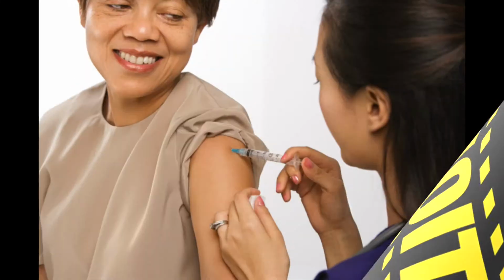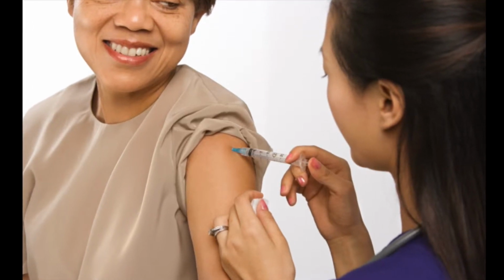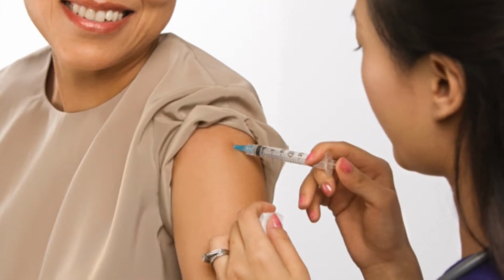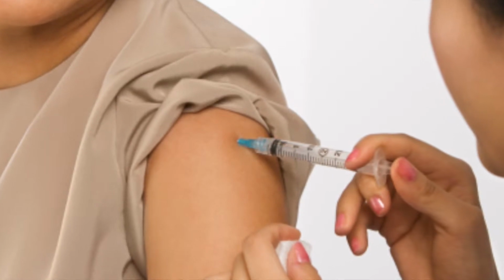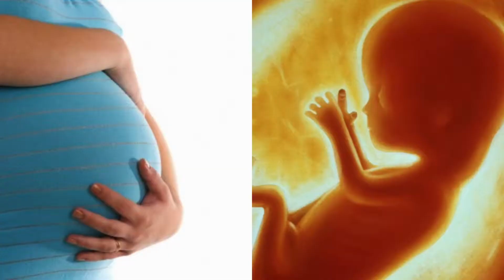There are hardly any severe harmful risk factors when getting a PET scan, but there are some precautions needed to be taken by the patient before being tested. During a PET scan, a person allergic to radiopharmaceutical may get a reaction. However, it is extremely rare, and it is usually diagnosed beforehand. Radiopharmaceutical is a radioactive compound, a drug used to diagnose when using the scanner. It is injected in the human body, which is explained in the How Does It Work section.